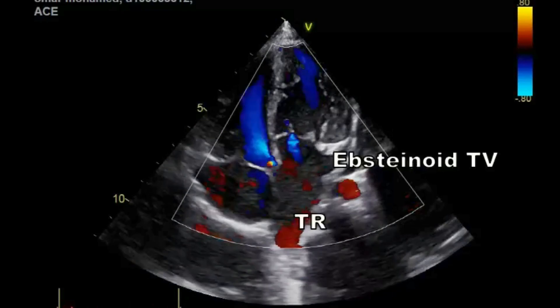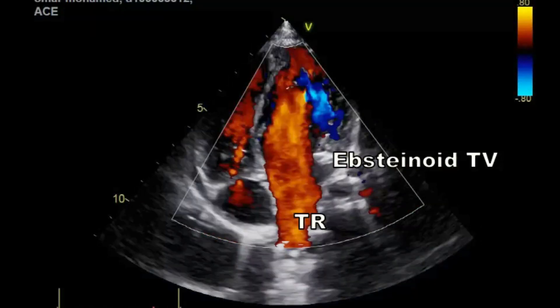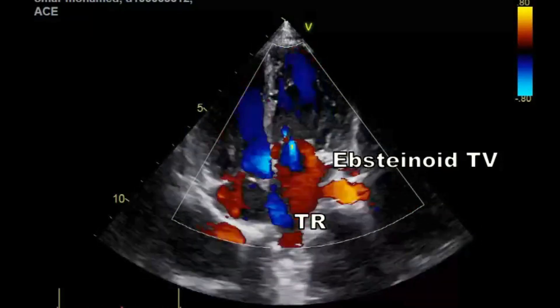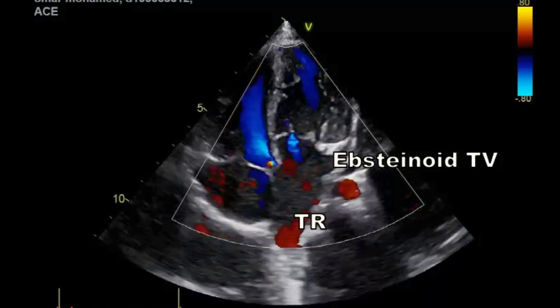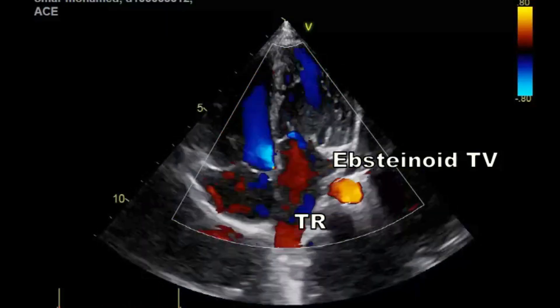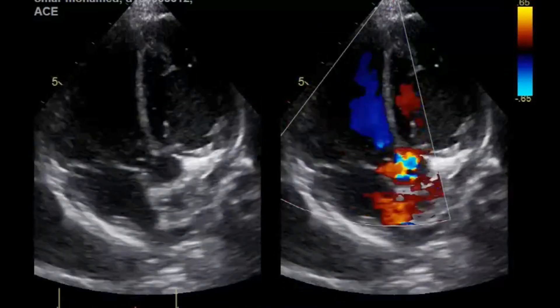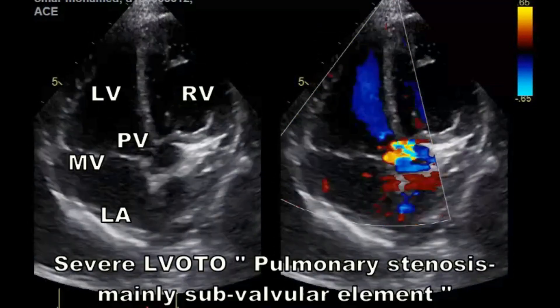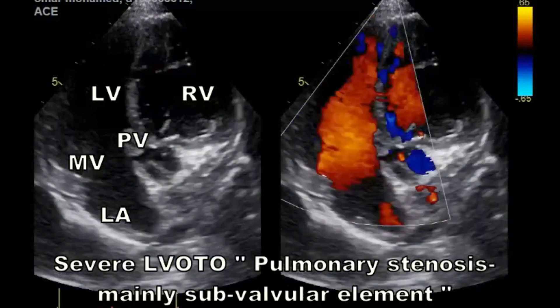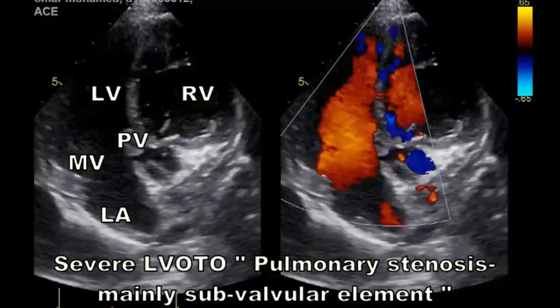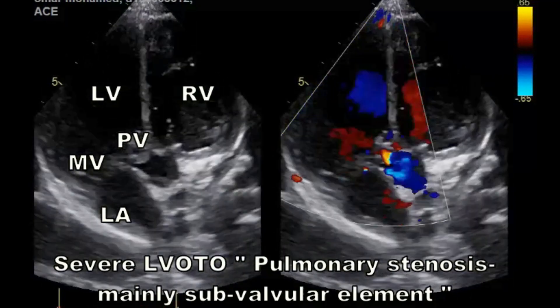Don't forget to search for the associated defects, such as Ebstein's anomaly of the tricuspid valve, and left ventricular outflow tract obstruction — subpulmonic or pulmonary stenosis.